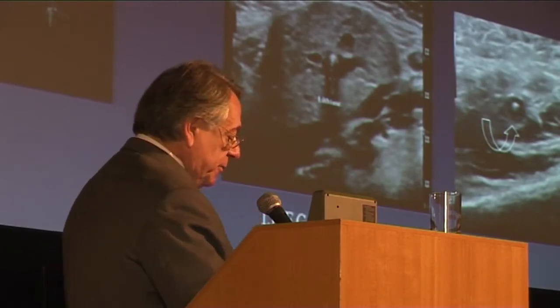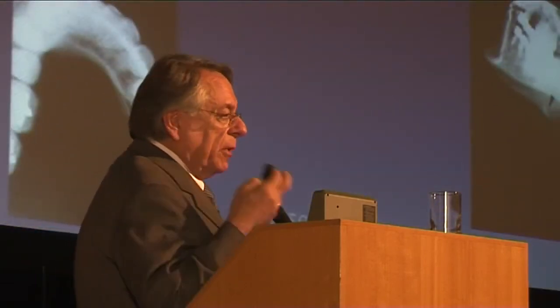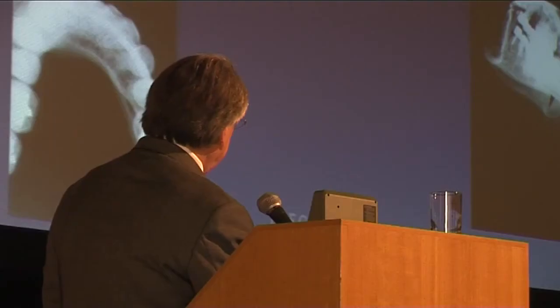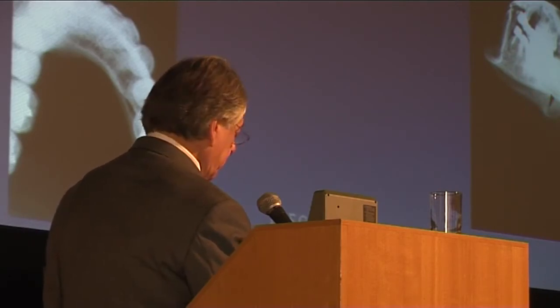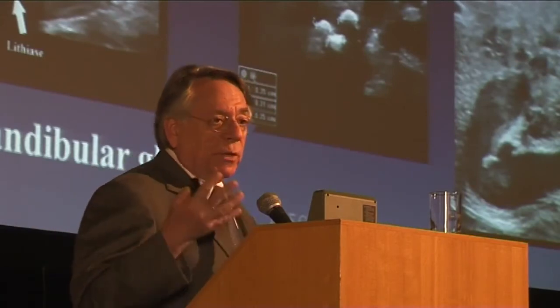Plain X-ray is very, very simple. You do a panoramic or a floor of the mouth view or anything like that, and you will see the stone. This is a child here. This is an adult. After, we have the ultrasound.